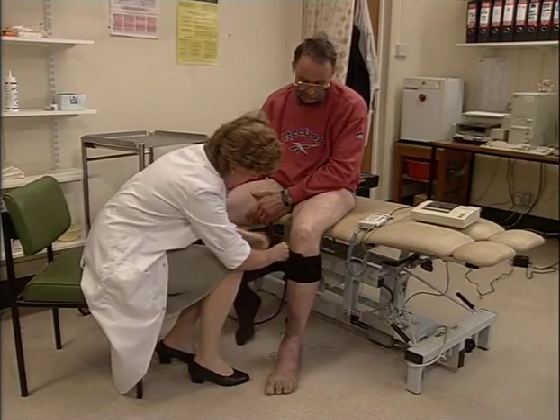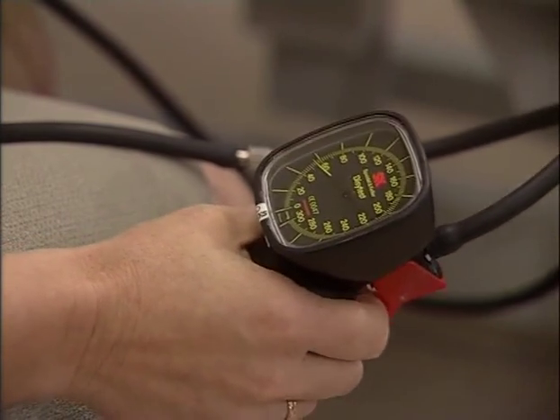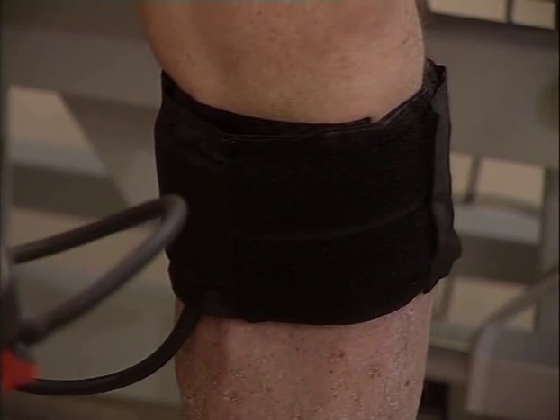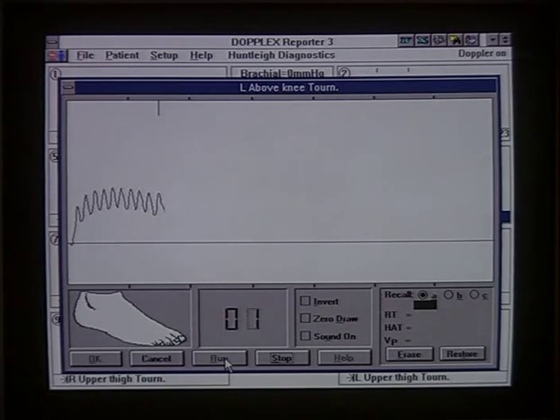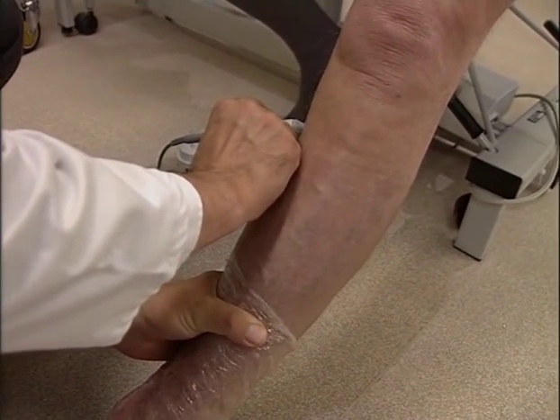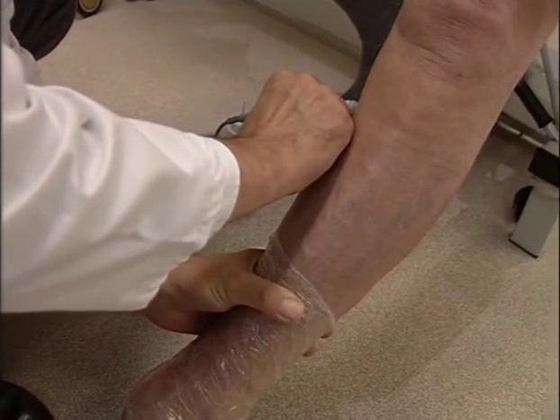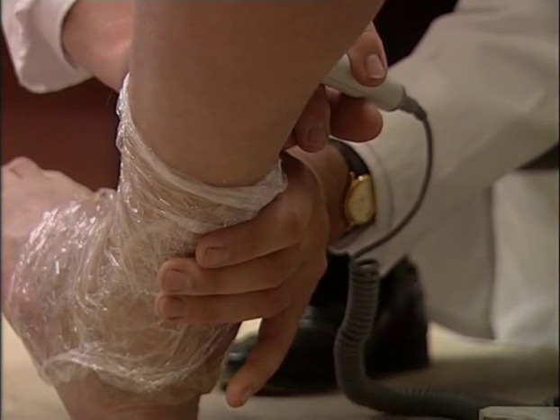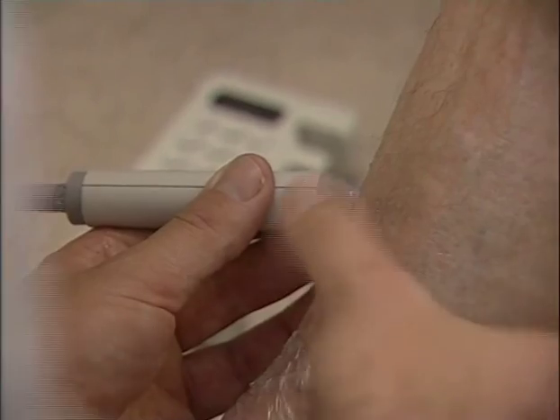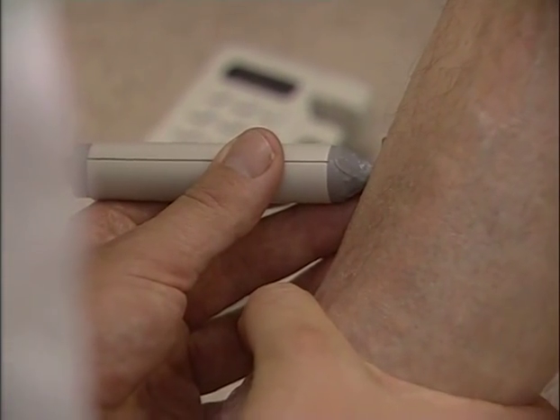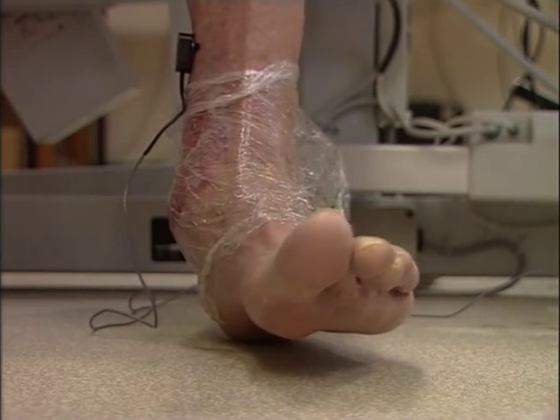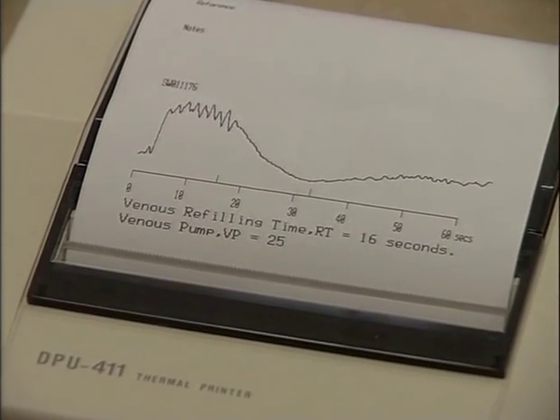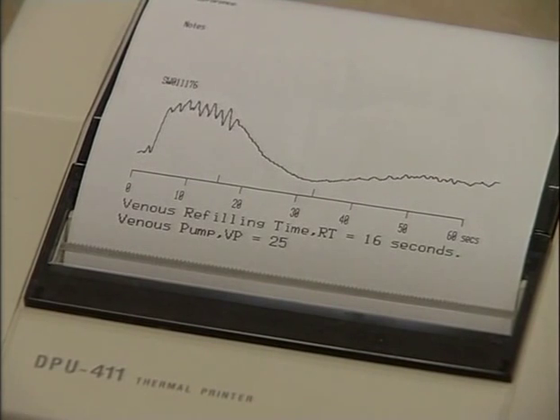The PPG procedure is repeated with a tourniquet cuff inflated to 50 millimetres of mercury. The tourniquet eliminates the reflux from the superficial veins above the cuff and is placed in various positions to localise venous incompetence. An abnormal result is dependent on the deep veins. The refill time shown on the computer screen is now 7 seconds, indicating the presence of deep vein incompetence. This patient, who has been suffering from a venous ulcer protected by cling film, has competent veins at the sapheno-femoral and sapheno-popliteal sites. Following the long saphenous vein down the leg, the rushing sound heard at this point indicates an incompetent perforating vein has been detected. Repeating the PPG procedure below the site of the perforation produces a refill time of 16 seconds, which is consistent with venous reflux at this level. Applying a below-knee tourniquet failed to eliminate reflux as the incompetent perforating vein is lower than the cuff.